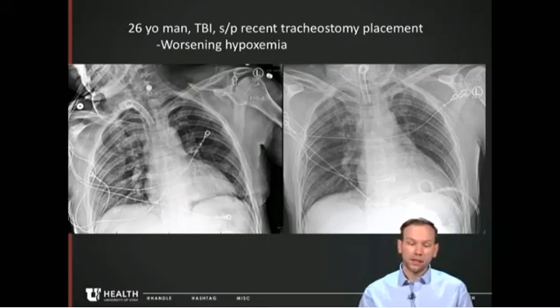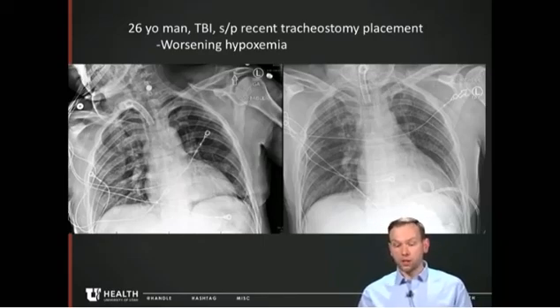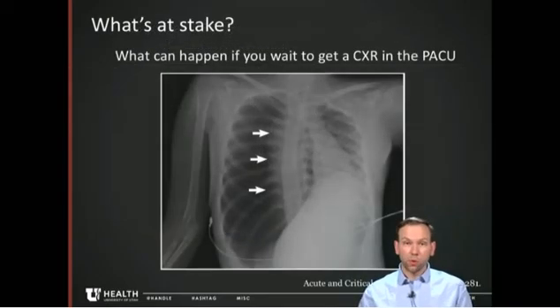And as you can see, the way that people are positioned with chest x-rays and CT scans, when they're in a supine position, as our patients often are in the OR, the air can hide at the top of the lung, and you can get lung markings throughout the chest that hide potential pneumothoraces. So what are the consequences of this limitation for us as anesthesiologists? Well, here is an example of one.